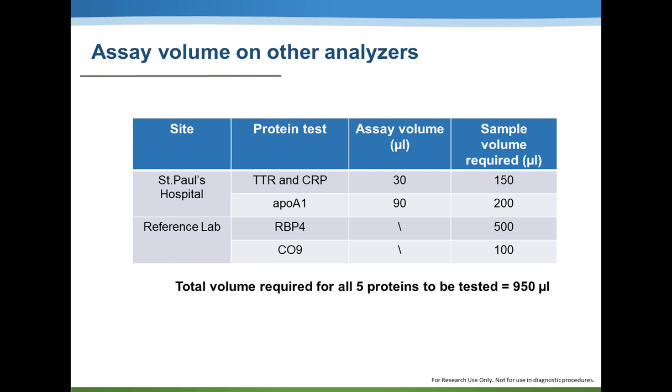Using less sample is a big advantage for mass spectrometry assays compared with immunoassays. It is important in a pediatric setting, or for people doing research when there are not many samples available for analysis. Consider a preterm baby in the ICU, how much blood he or she can provide, and also for people doing research using animal models, for example mouse, how much blood the mouse can provide, and how much blood people have in the biobank.